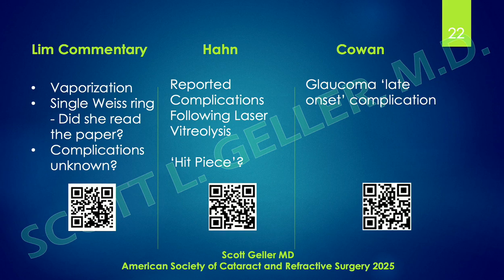The Cowan piece on glaucoma after YAG laser, their conclusion was that it was a late complication, late onset. But if you read the body of the paper, you'll find that after laser vitreolysis, there was quite a prolonged period of time before the patient was ever seen by an ophthalmologist. So they can't really say it's a late complication.